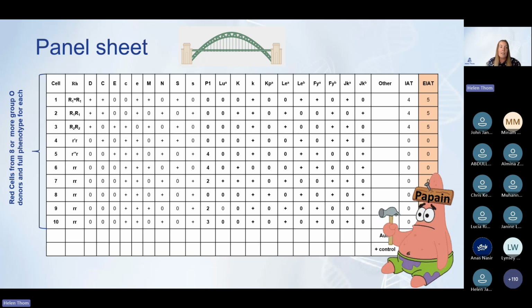It isn't just random. They may not necessarily be in this particular order. This is one of the NHSBT panels that I've used, so it might look slightly different in your laboratory. One of the things they have highlighted is that we have enzyme panels there. So in the reference lab, we tend to do enzyme IAT because that's really good at detecting Kidd antibodies, but you may just use an enzyme neutral card. So just be mindful when you are performing your antibody IDs in-house.